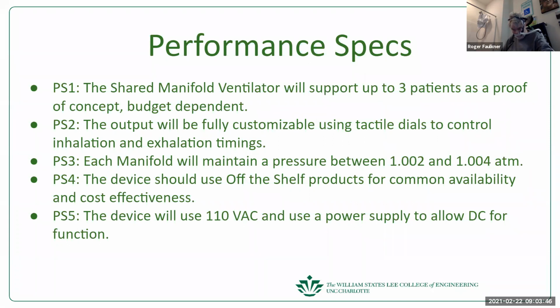If you're going to use the fluttering of the control valve to control the oxygen manifold pressure, you want to have the mechanical regulator set in position so that even if it fails, it won't be overpressure to a dangerous extent. So you've got a mechanical backup to prevent overpressurization of the oxygen.